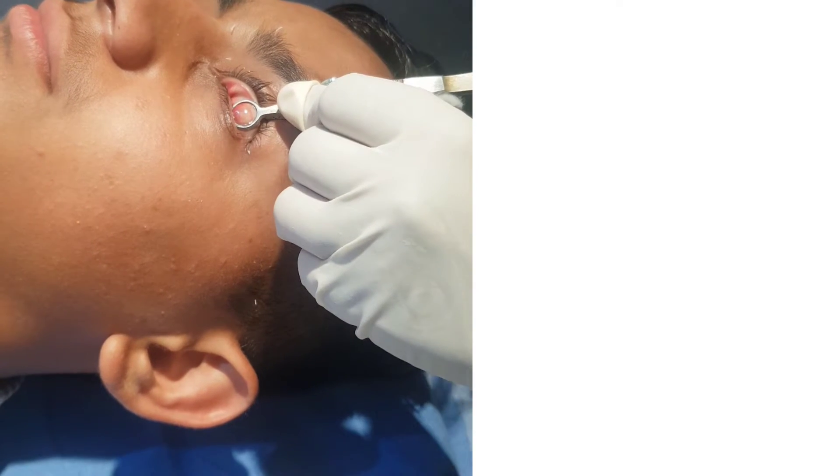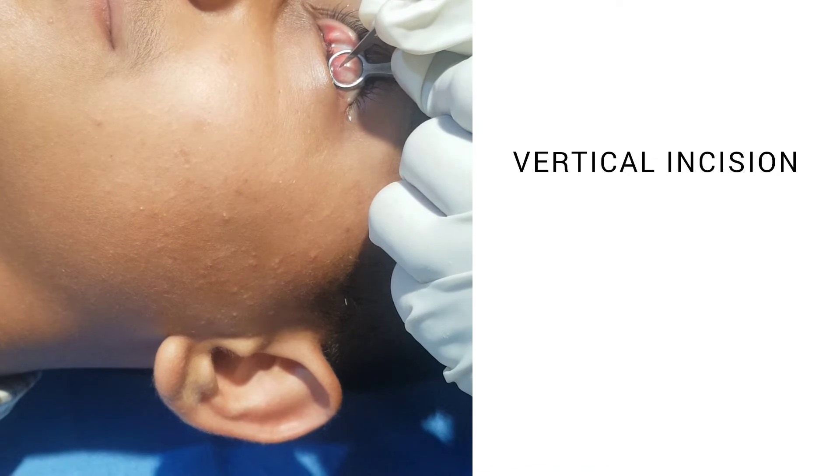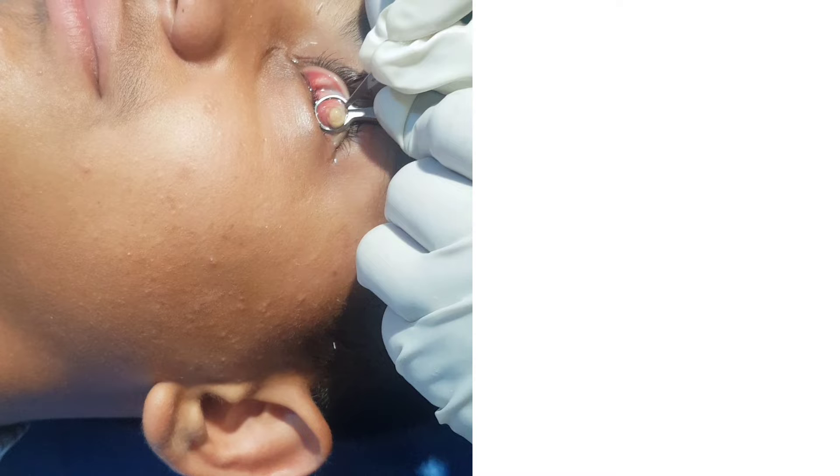Then a surgical blade is taken — blade number 11 — and an incision is made at the most protruding, the highest point of the chalazion. You can see in this video that I am holding the blade with my fingers, but in an ideal situation, or if you are a fresher, you should mount the blade on a BP handle and then make the incision, or else you might accidentally injure yourself.